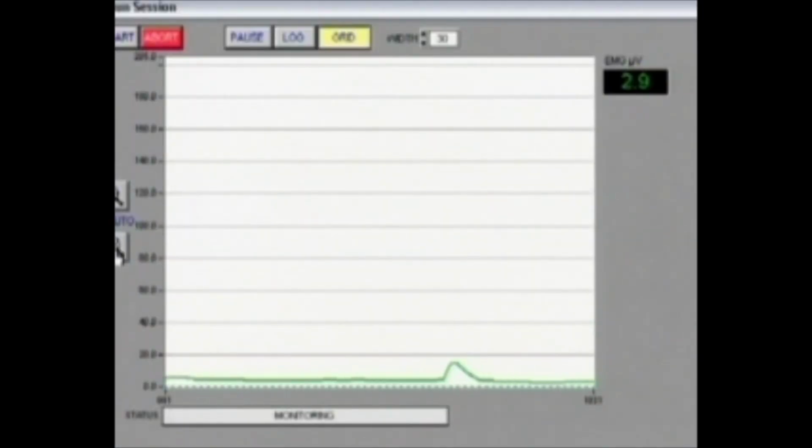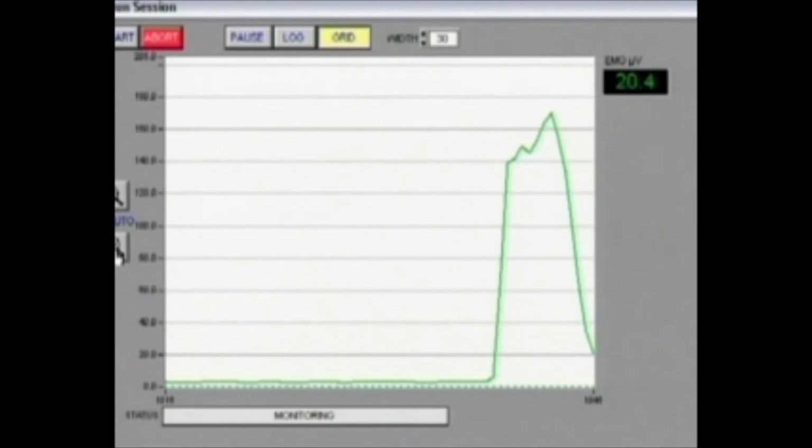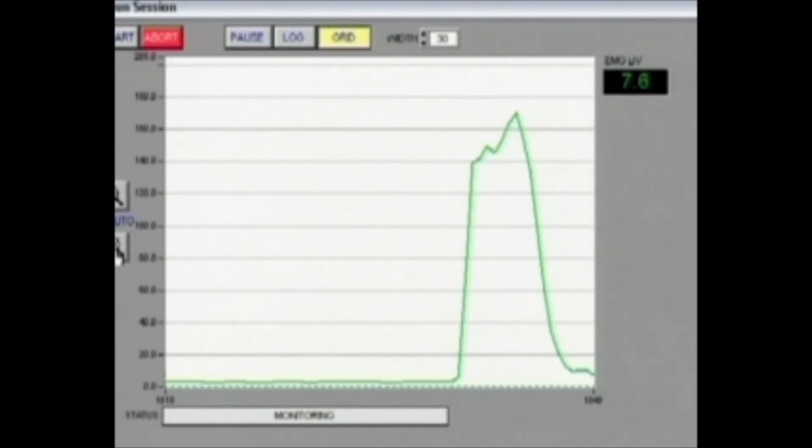Okay, Belinda, get nice and relaxed there, so perhaps head back now and just let the jaw muscles relax, and we can see that the printout on the screen is around 2.8, 2.9 microvolts, so that's measuring the amount of muscle activity that's happening in the clenching muscle region. So Belinda, I'll get you to have a clench as hard as you can go. This is just on your own natural teeth, so clench as hard as you can go, and let's just see what you can get up to. That's the way. Okay, I think you got up to about close to 170 then, so just nice and relaxed.